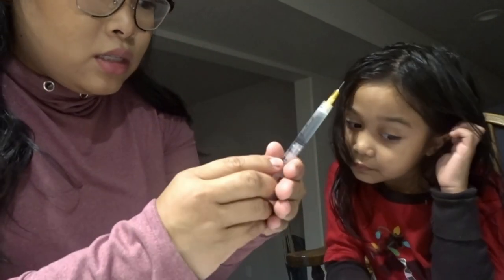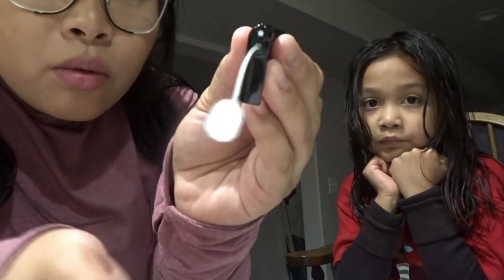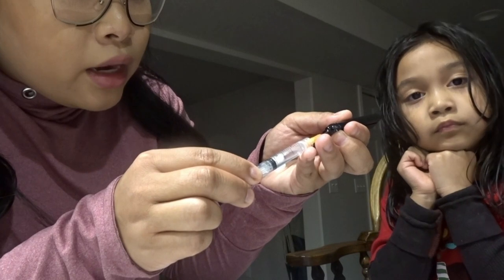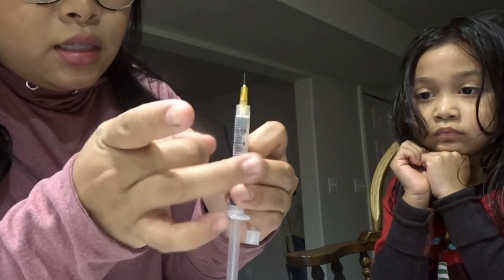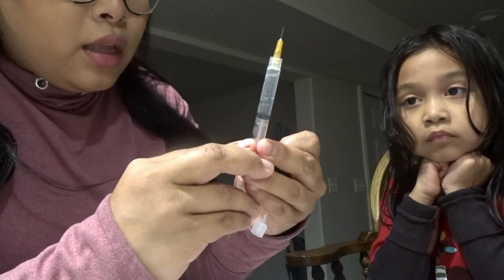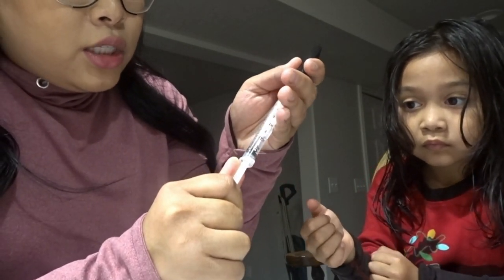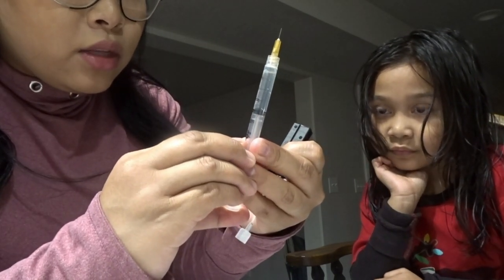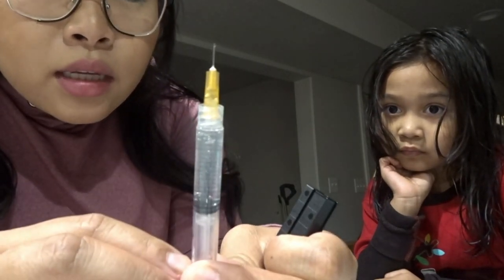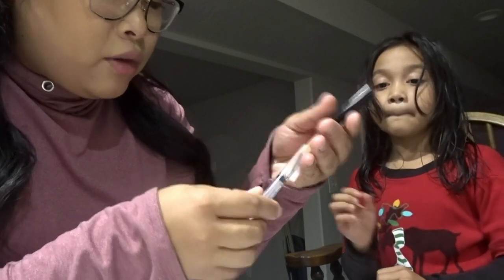I just took all the insulin out of that vial because it's pretty much done. With the new cartridge - don't worry about those air bubbles - I'm going to stick the needle into that white little part and extract the air. That's going to help with air bubbles in the insulin because you don't want any. I do it twice - push out the air, then do it one more time. Now tap out the air bubbles and push until you see the insulin bubble at the top. Keep tapping to make sure there's no more air bubbles.